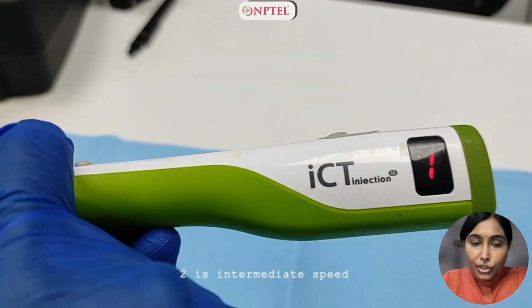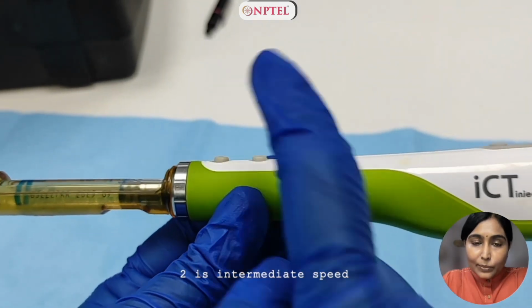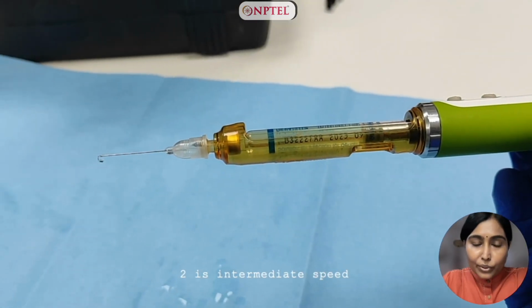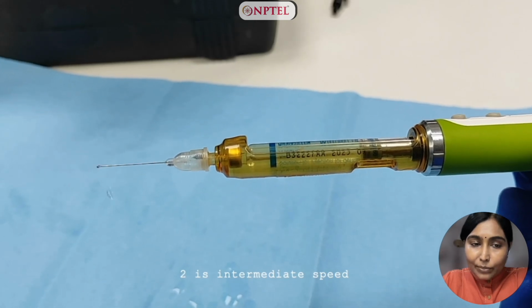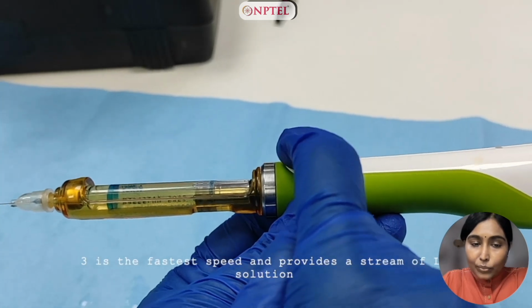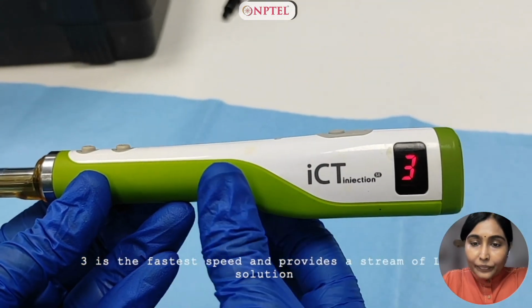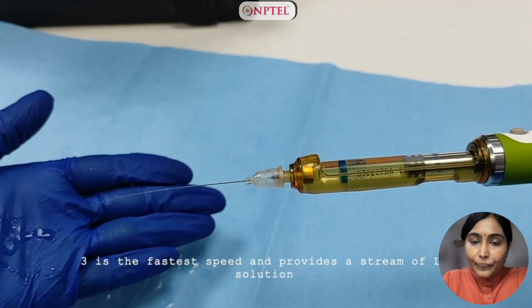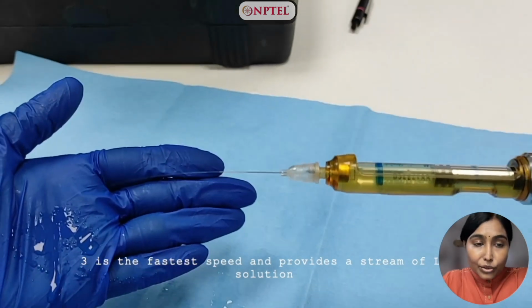Now we move on to the second or the intermediate speed. Once that is pressed, you see the change in the setting on the display board. Now you can see it's very obvious the speed is intermediate, much more than what it was in the first setting. Now we move on to the third. This is the fastest speed. There it's changed on the display. Now as you can see, it provides a continuous stream of local anesthetic solution.